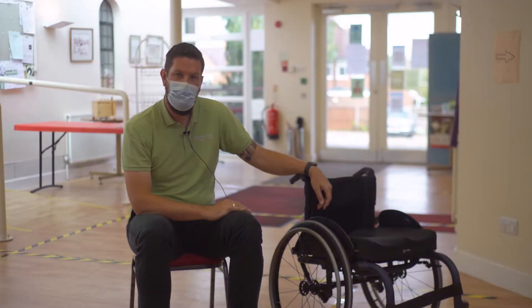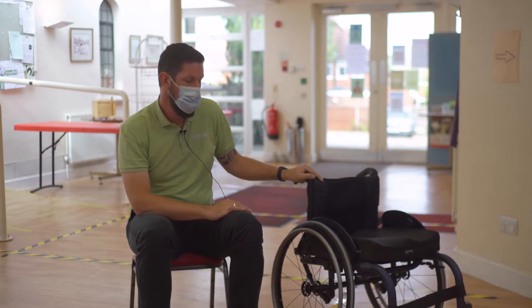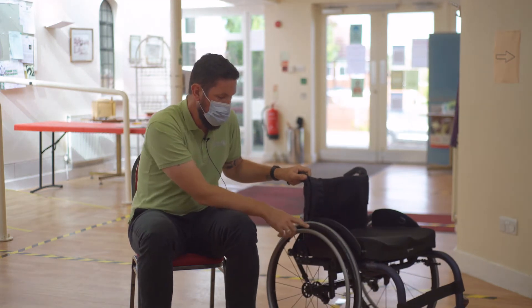Having your tyres inflated to the correct pressure is quite important. It helps to reduce rolling resistance. Your tyre pressure is written on the side of the tyre.